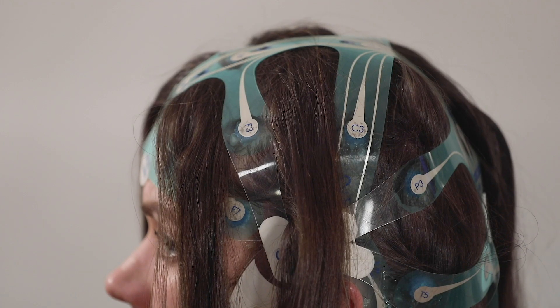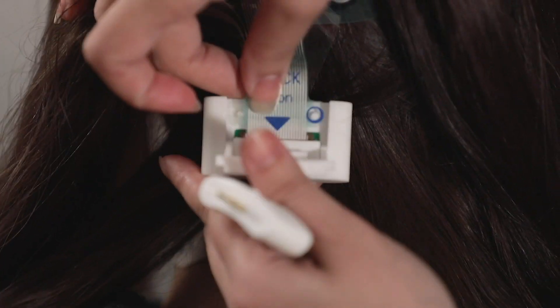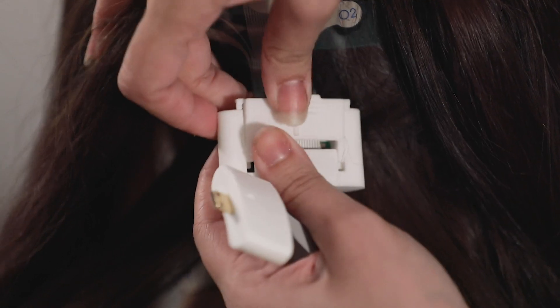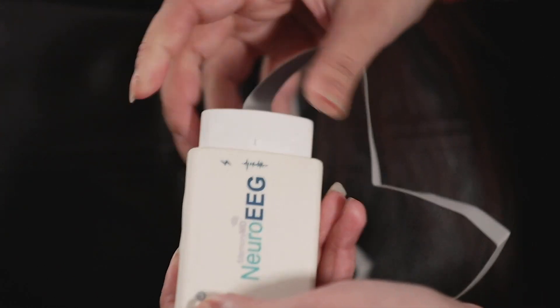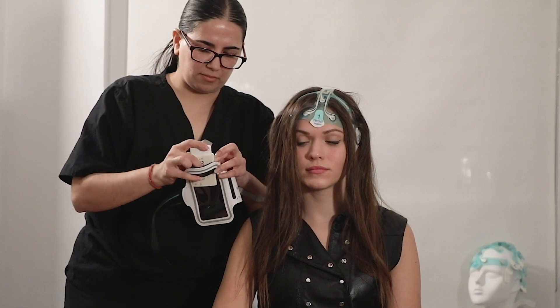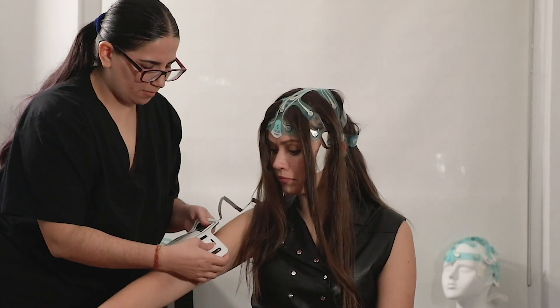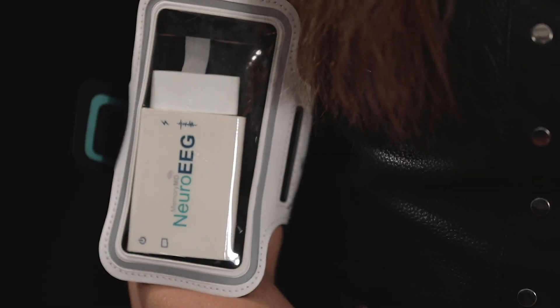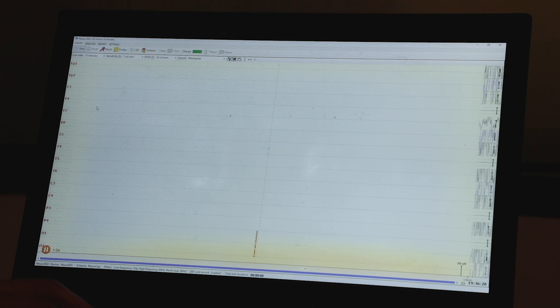Connect NeuroCap to the NeuroEEG amplifier via the standard cable that comes in the package. Open the cable latch and hook NeuroCap via the two holes on the tail end of the connector. Plug the male end of the cable into the female connector of NeuroEEG. Turn on the device by pressing the power button for several seconds and place the amplifier in an armband sleeve. Note: NeuroCap can be connected in a similar manner to any commercial EEG amplifier via the universal cable.